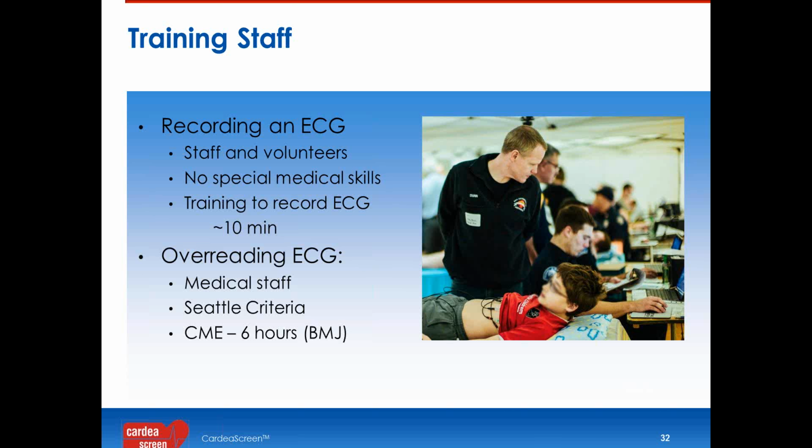Training. We routinely do high school screenings here in Seattle with an organization called Nick of Time Foundation. It's probably one of the national gold standards for how to screen high school kids in a gymnasium environment. We'll come in the night before and set up.